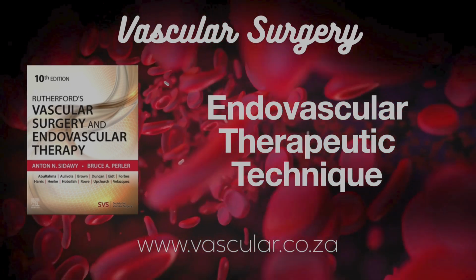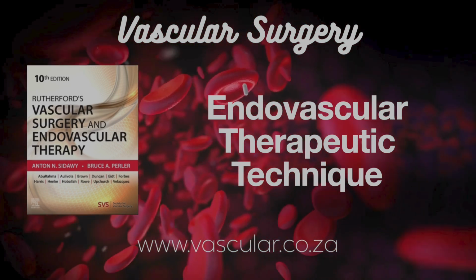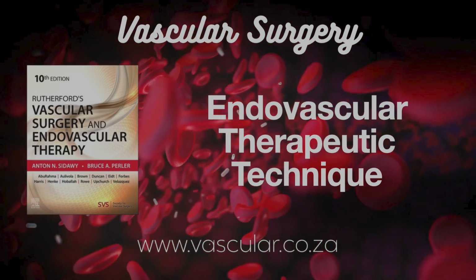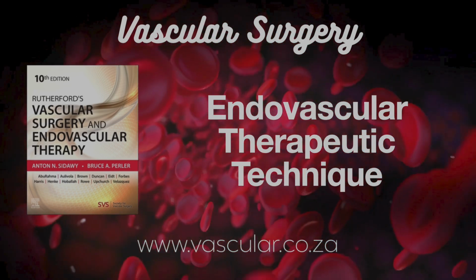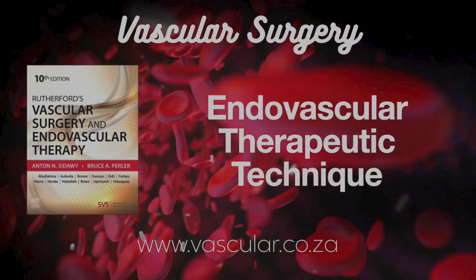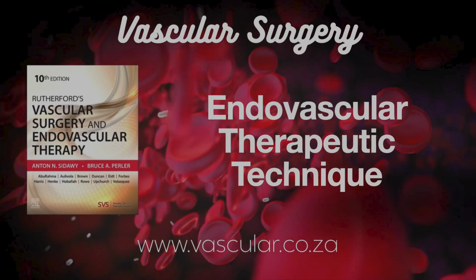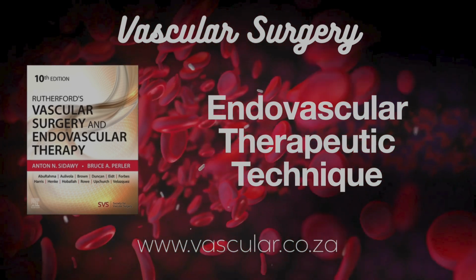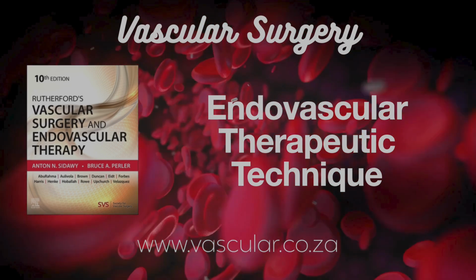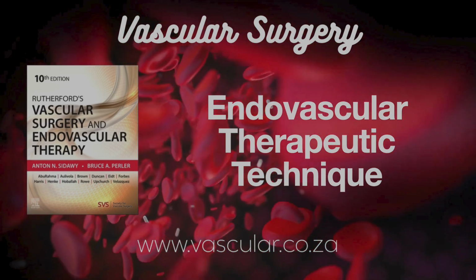But there have been successes more recently. Newer peripheral DES? Yes, definitely. The Zilver PTX stent from Cook Medical has been a significant one. It's polymer-free, elutes paclitaxel directly from the stent surface. How does it release the drug? Mostly in the first few days, but detectable levels stay for up to 56 days. A big randomized trial showed it had superior primary patency compared to both PTA alone and PTA plus a bare metal stent at 1 year in femoropopliteal lesions. And that benefit held up out to 5 years.